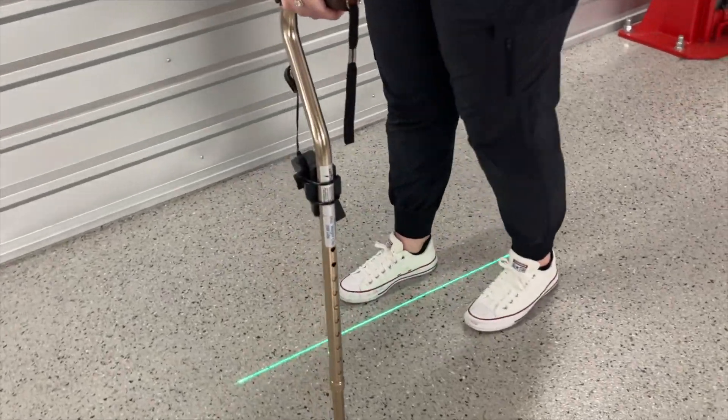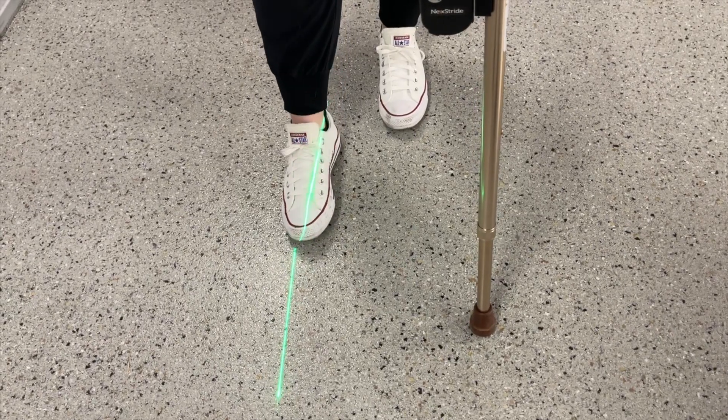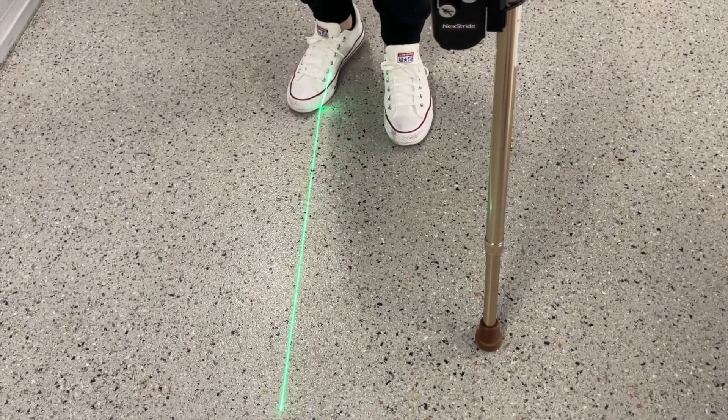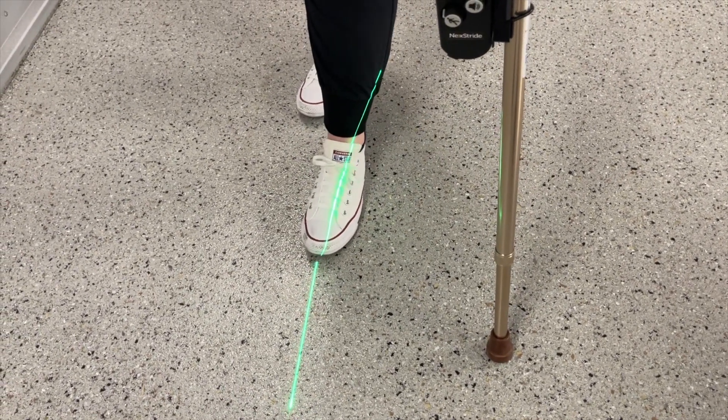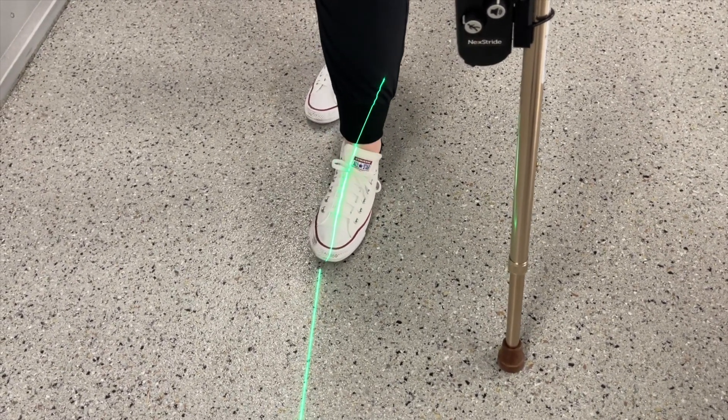First, make sure your Nextstride device is projecting a vertical laser line instead of a horizontal one. Step onto the line and try to bring the laser from one side of the foot to the other. This is helping teach your body how to move your ankle to help you keep your balance.